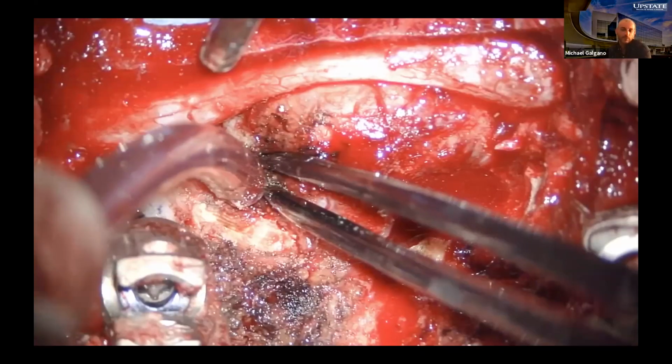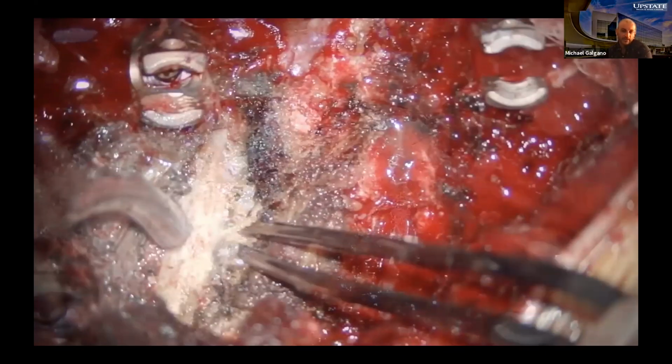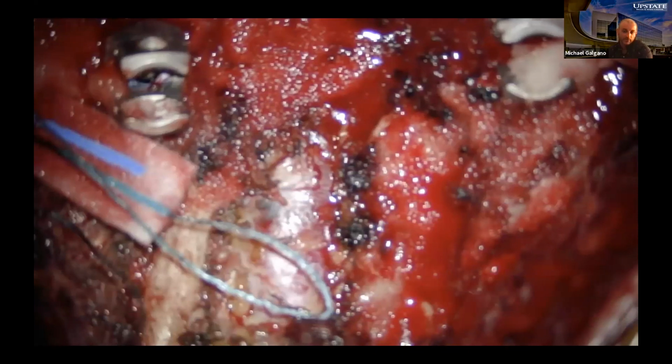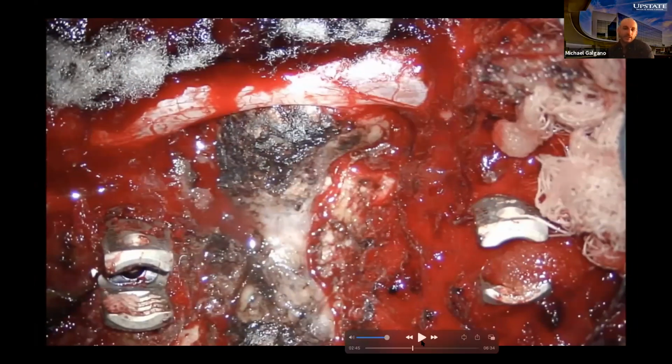So basically what we did was I wanted to get good circumferential control of this tumor, for a couple of reasons. I think it's less hemorrhagic, right? If you get into one of these nerve sheath tumors, they could be pretty bloody. The other reason is that if this was something more malignant, I did want to try to stay on the outskirts of it, although my suspicions were that it was benign. This is a pretty neat picture you don't get to see too often. This is the true dumbbell nature of this particular type of pathology, where you can see the foraminal component and extraforaminal component.